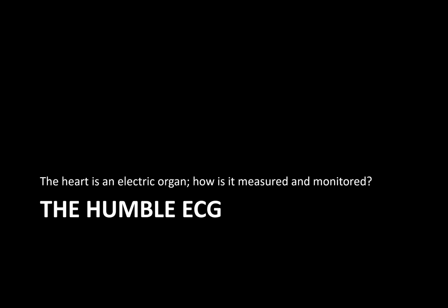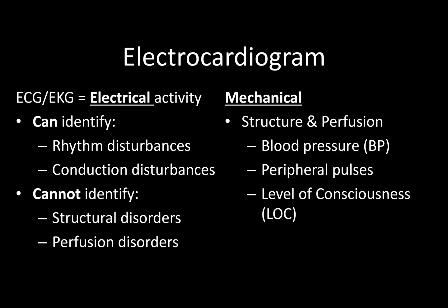All right, so we've gone over anatomy and physiology. We've talked about electrophysiology. Now let's discuss how we measure that. Because if the heart is an electrical organ, there has to be a way for us to track that. So here we go. The answer to that question is the electrocardiogram, known as either ECG or EKG.